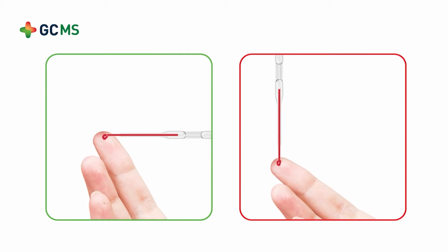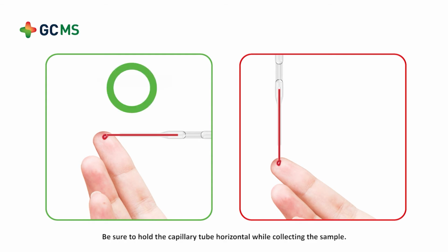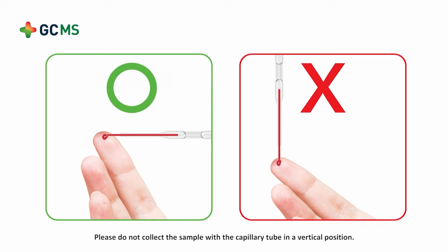The blood will be drawn automatically. Collect blood from the surface of the drop of blood. Be sure to hold the capillary tube horizontal while collecting the sample. In that way, you can avoid air bubbles. Please do not collect the sample with the capillary tube in a vertical position.